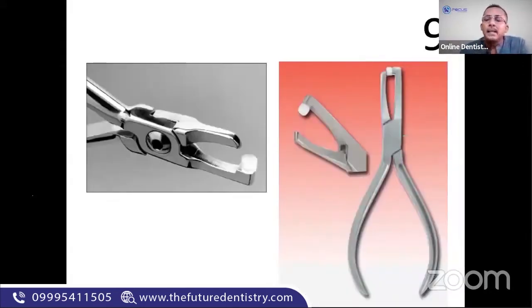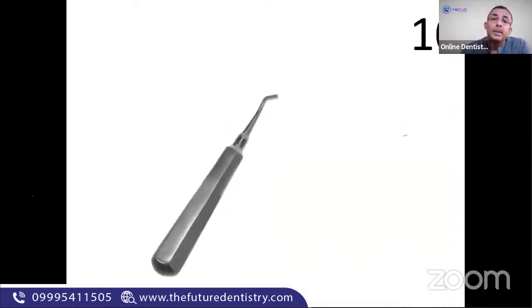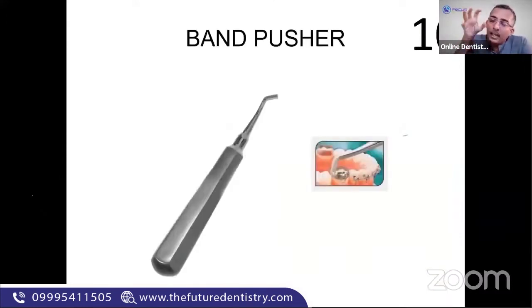Now, next thing is question number 9, identify this appliance. This is a band remover used to remove bands. Again, used very commonly in pediatrics as well as orthodontics. Band pusher is pushing the band in, is a band pusher. Not a very common question. I've seen it in an Australian board exam. I saw this question, so I just thought I'll just give all the armamentarium here.